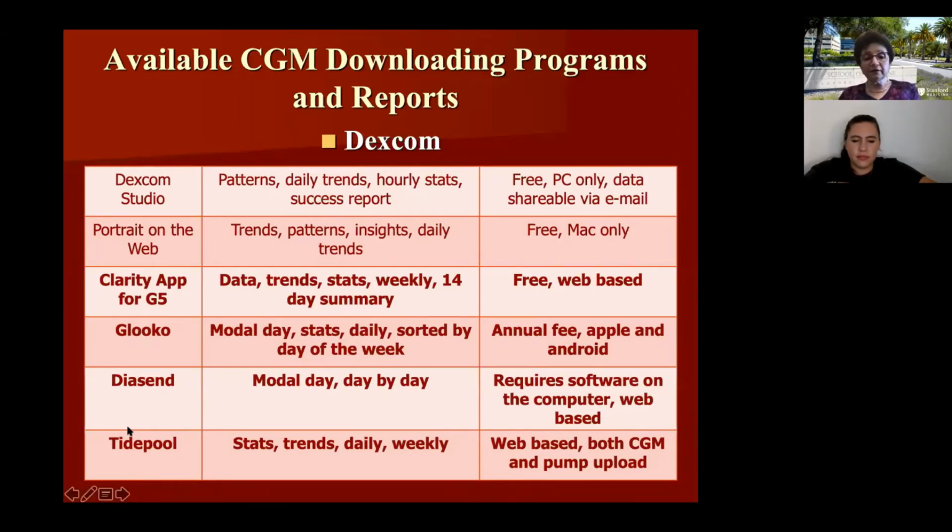Diasend is no longer available, but Tidepool is a great resource. It's a free data download. It's very interactive. You can download multiple devices. If you are on Omnipod and Dexcom, you can merge those two together in one program. So that would be more useful to look at than flipping from one view to another. So it's a really useful tool.